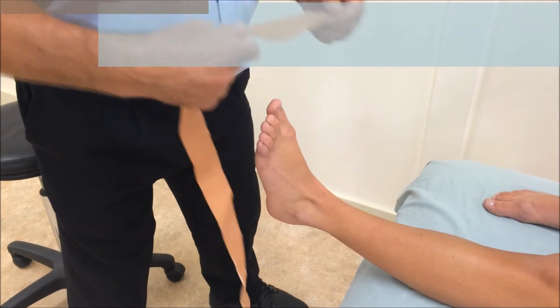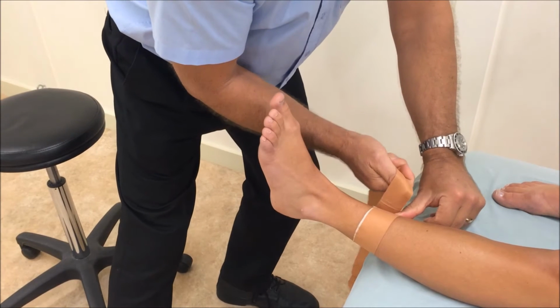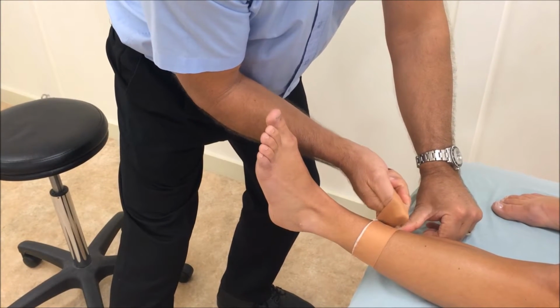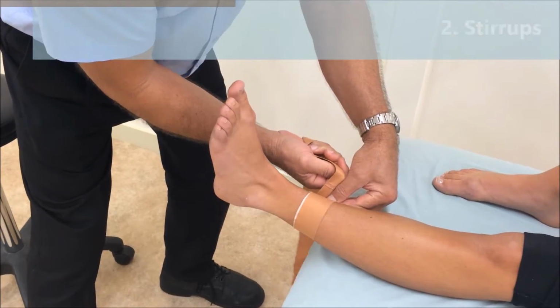Okay, we're starting with an anchor. The anchor goes on about the top of the sock height and wraps gently around with little pressure, and it's a starting and finishing point for all the strapping of the ankle. It's called the anchor, just laid on gently so it doesn't cut off circulation. After the anchor, we move to the stirrups.